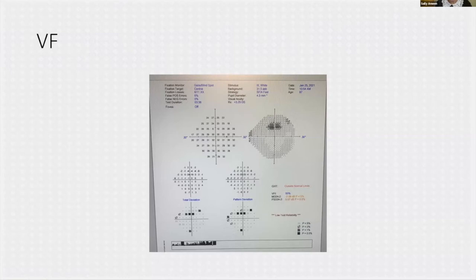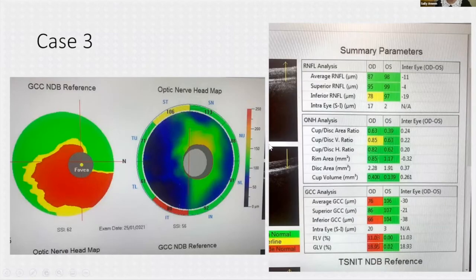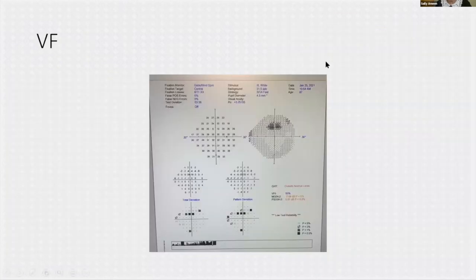Because he has normal pressures, he has essentially what looks like a healthy optic disc, nothing that's worrying, but he has this query visual field defect. And unfortunately, you will be faced with this day in and day out on a regular basis, because the world is not textbook, and the picture doesn't fit together. And then that's when you have to remember that it's the whole picture and not just a visual field that can help you make the diagnosis and make the ultimate plan.